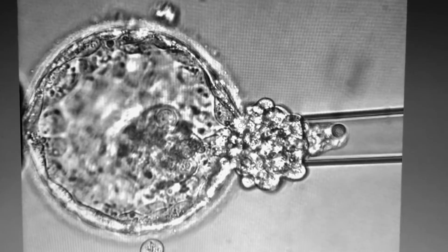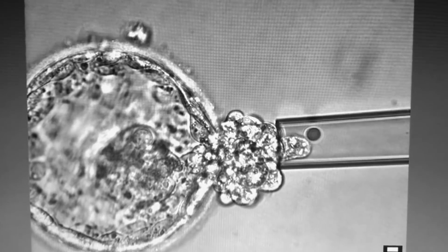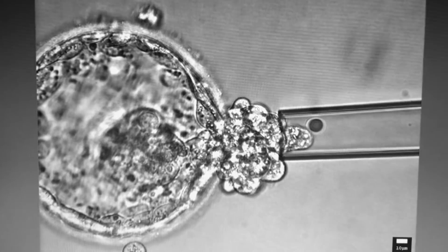Typically anywhere between 3 to 8 cells are collected and are then put in a special buffer, wherein approximately 3 to 6 microlitres of solution is sent for further analysis.